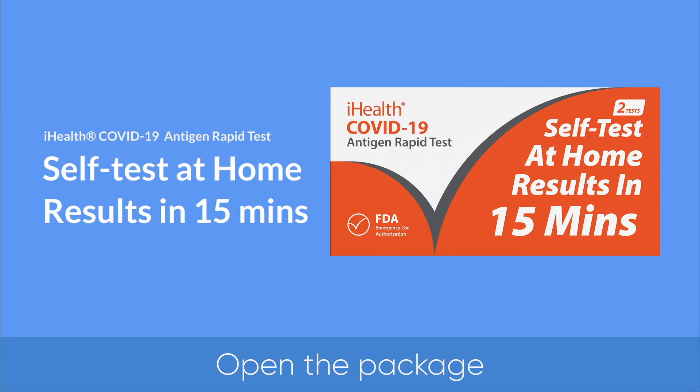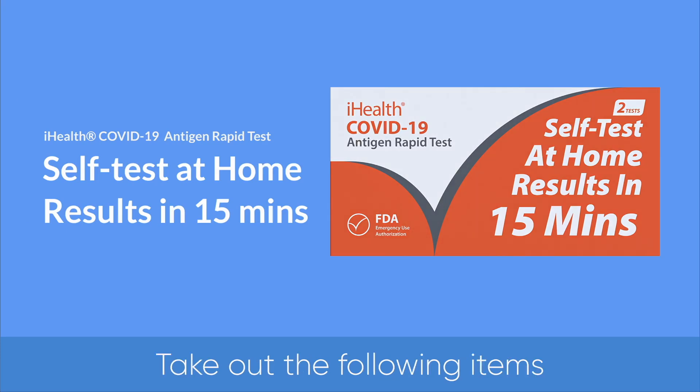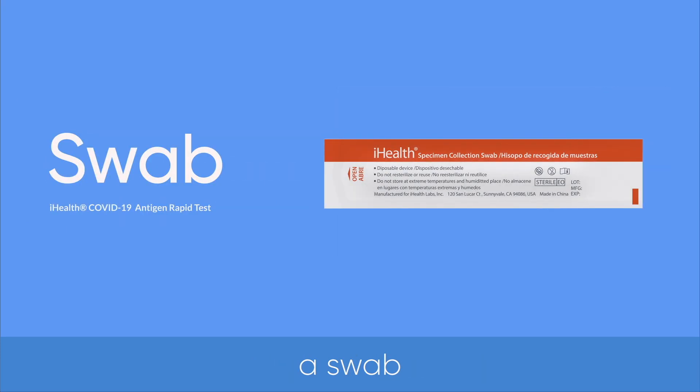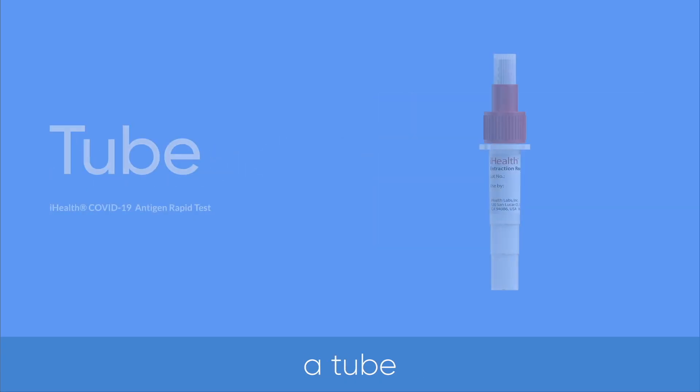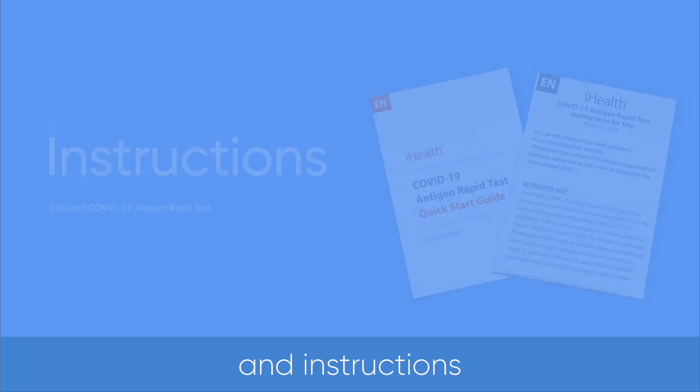Open the package. Take out the following items: a swab, a test card, a tube, and instructions.